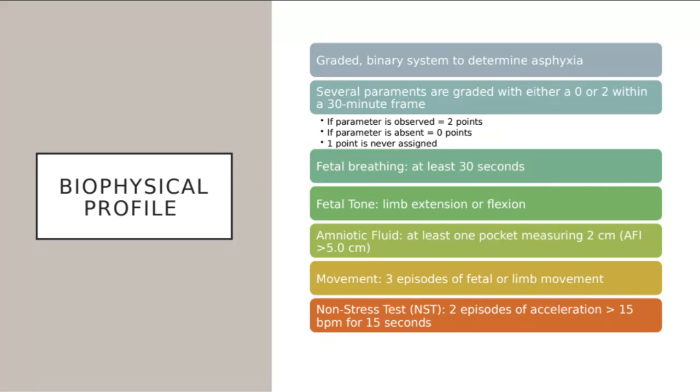And then after a few seconds, 15, 30 seconds, you're going to hear that heartbeat go back down to normal. And then they're going to move again, and then it's going to go all the way back up. So that's normal, and we want to see that in the baby. We want to see those fetal heart accelerations after that baby has moved, or really for any particular reason, but it always is going to happen after that baby moves of some sort.